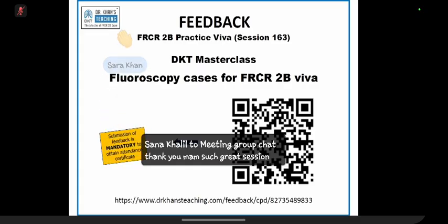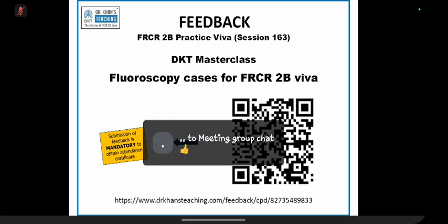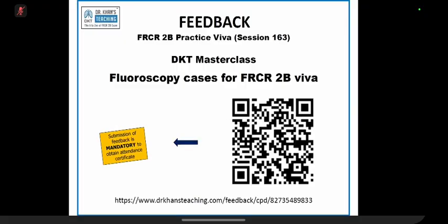And another important thing is that other types of malignancies or small bowel diseases can be viewed on other kinds of modalities as well. Okay. For example, you can see in small bowel enterography, on the CT, on the MR. So there might not be enough cases, but whatever is shown here, you can get 1 or 2 scenarios in the exam. They do not show atypical presentations. They just want to see your approach towards a particular case.